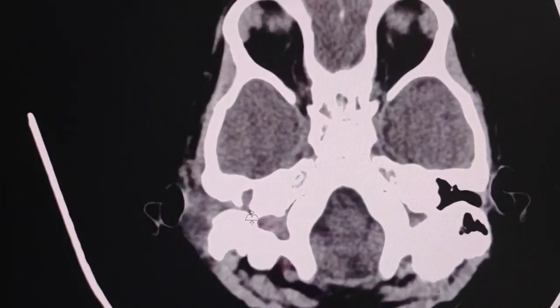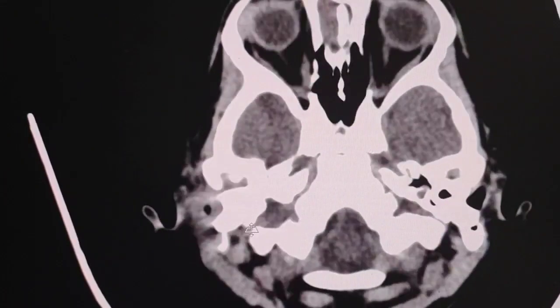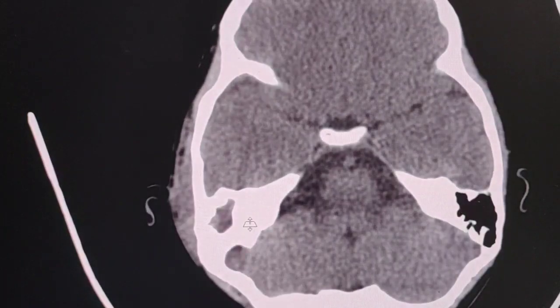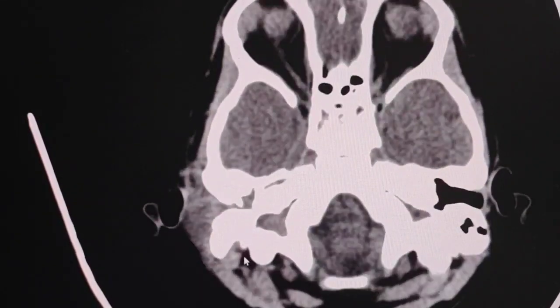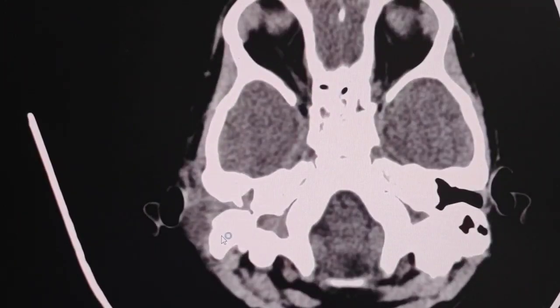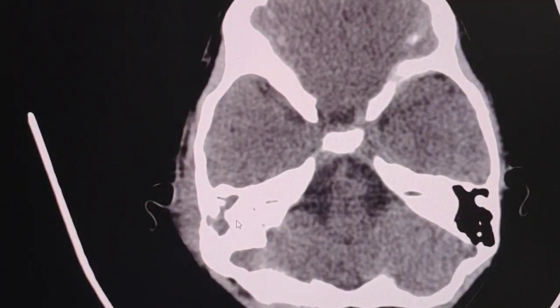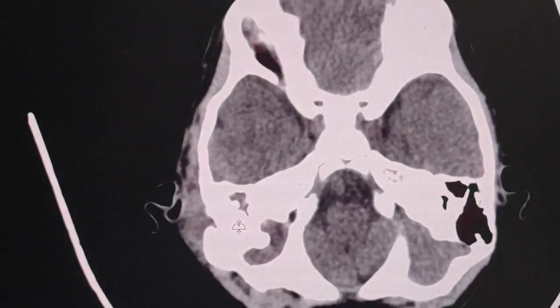petrous bone. There is hypopneumatization of the right middle ear, and there is also hypopneumatization and some changes in the right mastoid cells — we will see in bone window as well.